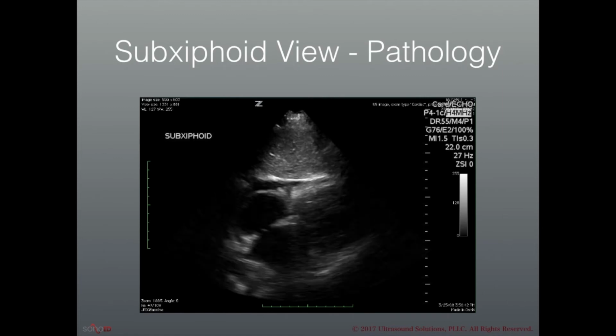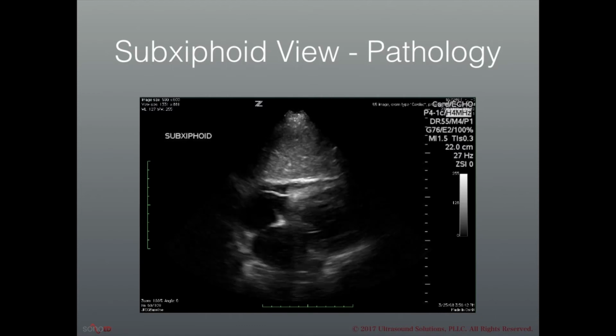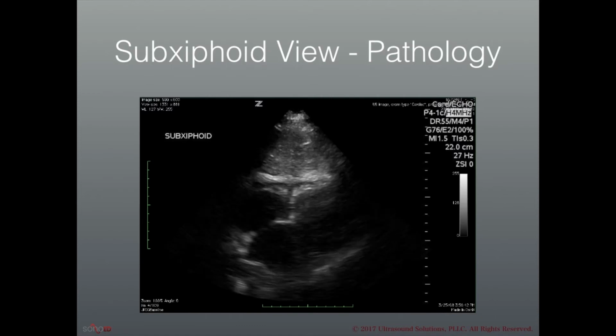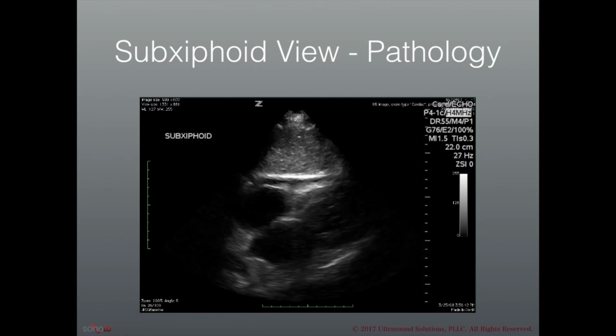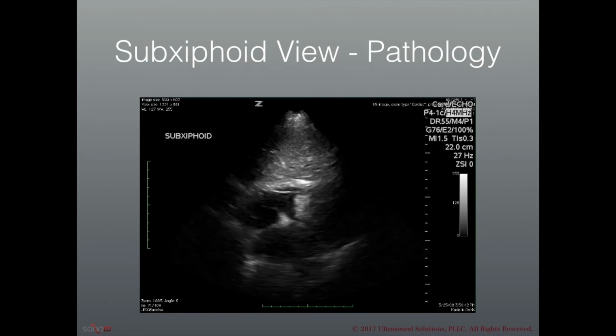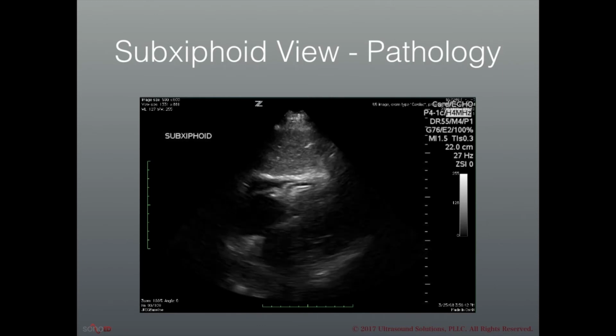To really make a firm call on that, I'd want more views because there's some degree of artifact, and it may be that the squeeze of the left ventricle is appropriate and just overwhelmed by some of the artifact. So I'd want more views on this, but you get a good amount of information even from a view such as this.